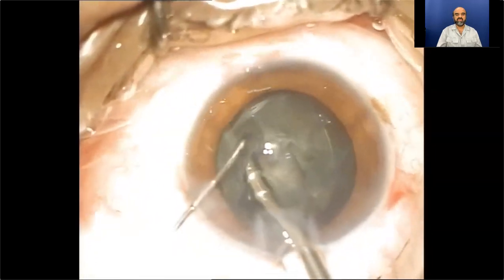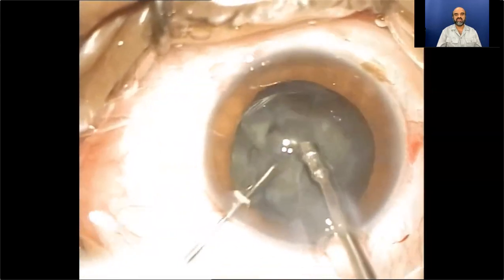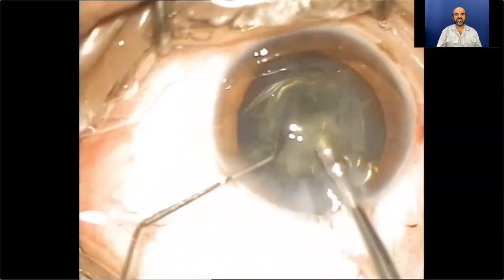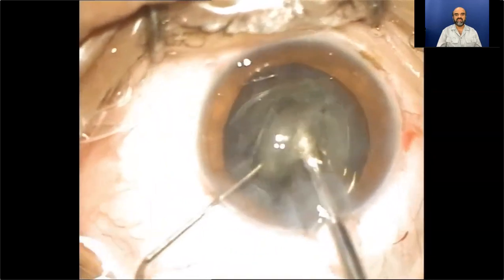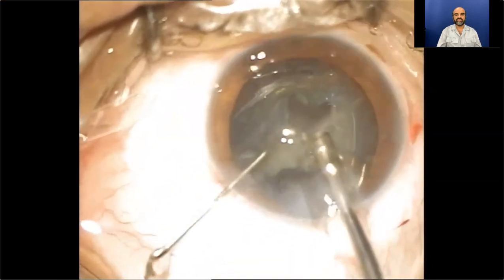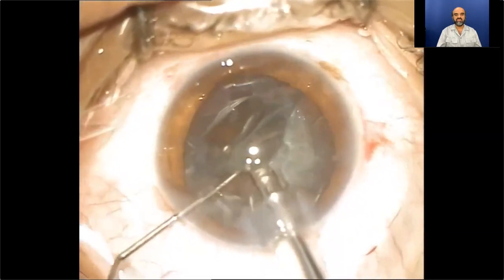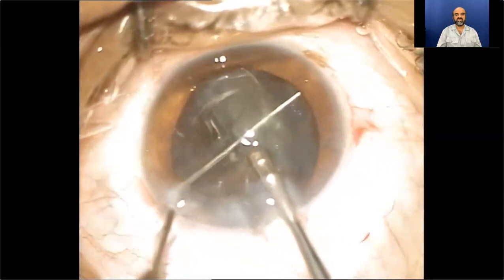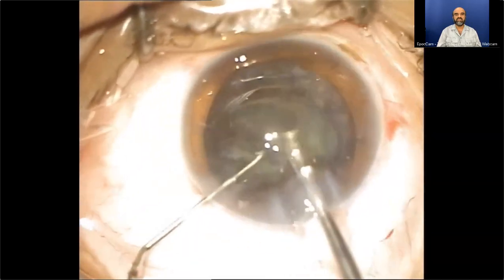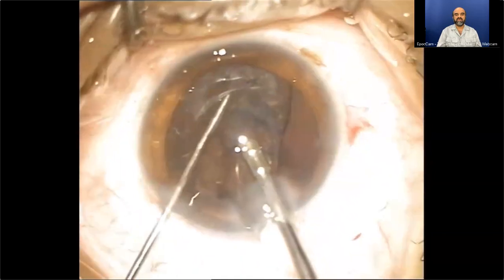I try to crack the nucleus and realize it is probably a soft cataract — cracking is not possible — so I modify the technique and keep on creating a central crater until the nucleus becomes disengaged and everted at one end and is easily emulsified. After emulsification of the nucleus, the perinucleus is taken care of and softly emulsified.